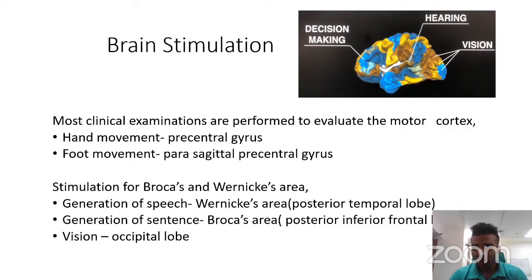We already talked about what fMRI is. I just need to make sure that by the end of the session you get at least an idea of what fMRI is all about. Whatever activity you do, there are certain regions in your brain which control it. So I would like to talk about some of the activities and the respective regions in your brain which control them.